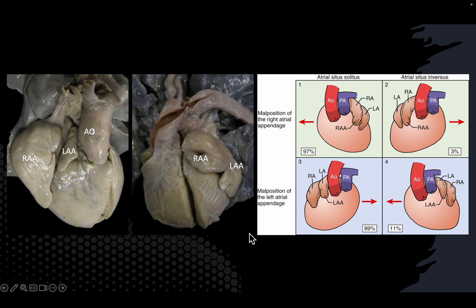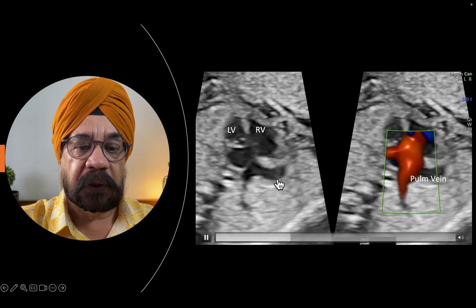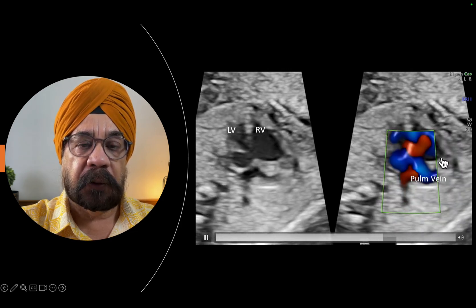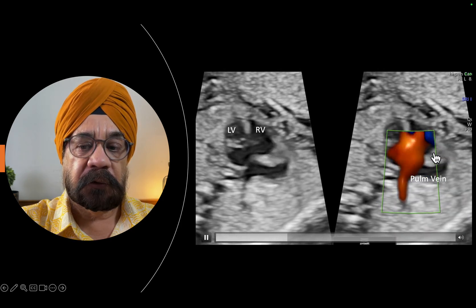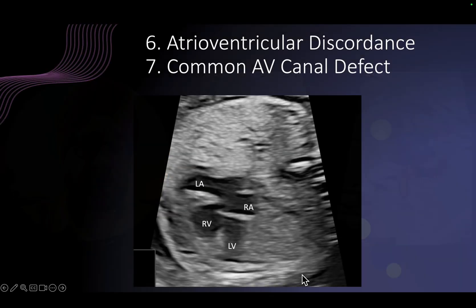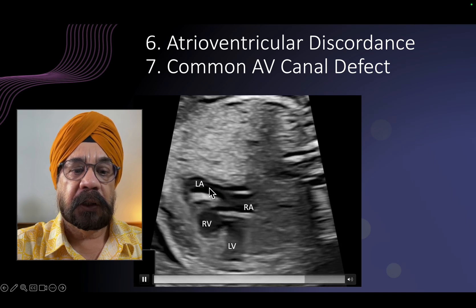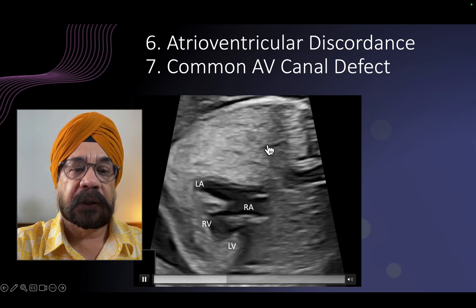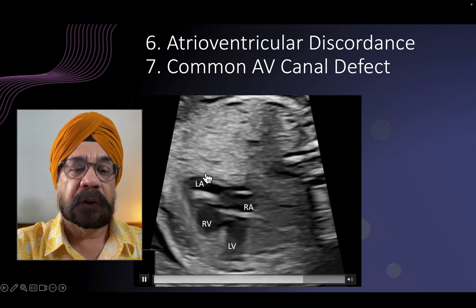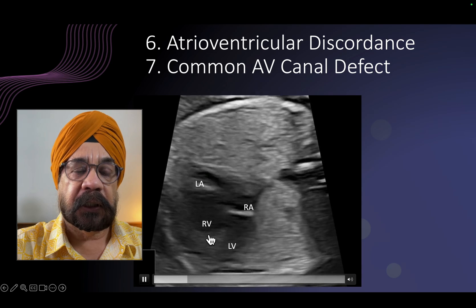Now let us see the pulmonary vein. The next step in the segmental sequential approach is the pulmonary vein. After we see the atria, you see the pulmonary vein opening into the atrium which is on the right side of the fetus — so this is the left atrium lying on the right side of the fetus, with the pulmonary vein draining into it. In this patient there was atrioventricular discordance. You see this is the left atrium on the right side because of situs inversus totalis.